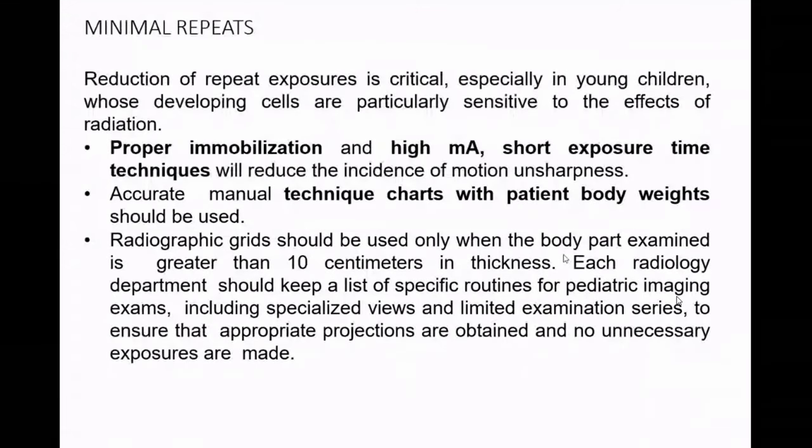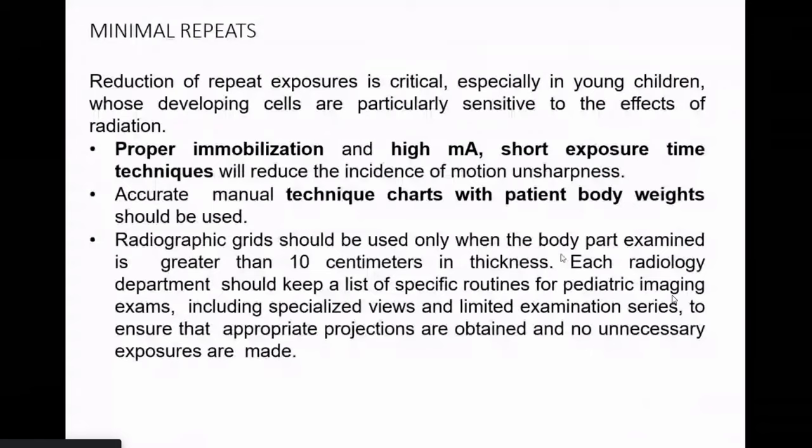So for the reduction of repeat radiography, we can use some steps, that is, the use of proper immobilization devices. That means which device we can use so that we can get better image quality. Like if we are doing chest radiography or abdomen radiography technique, or if we are using any extremity devices, we can use sandbags and positioning devices.